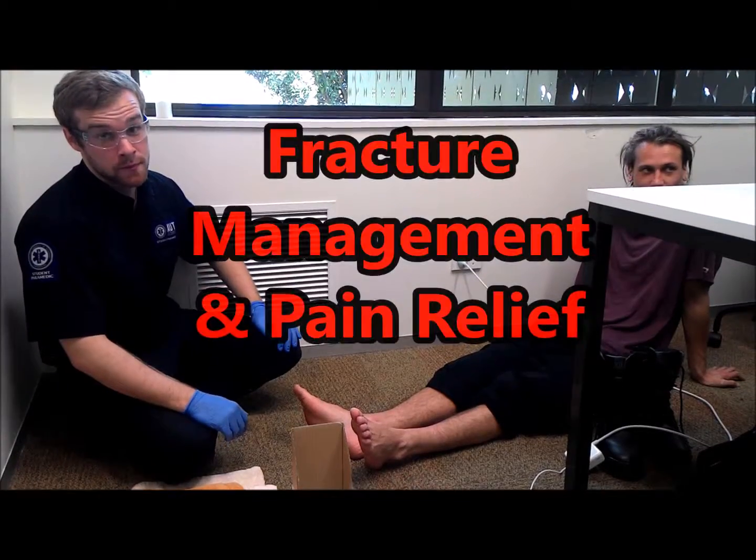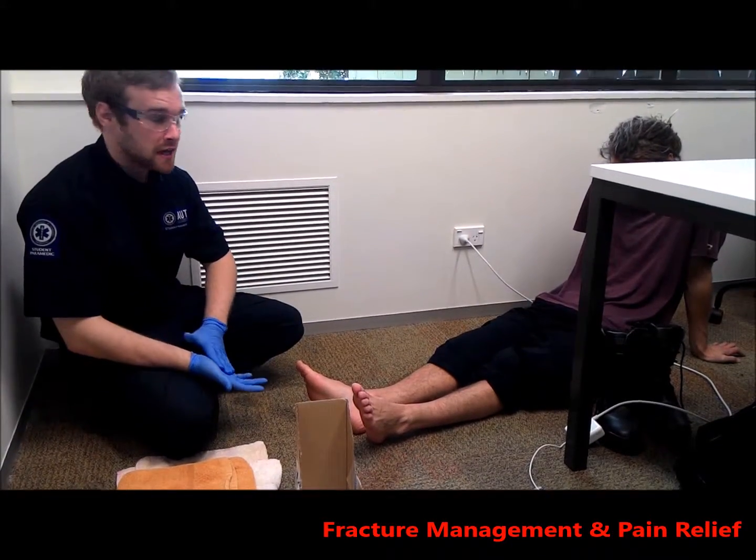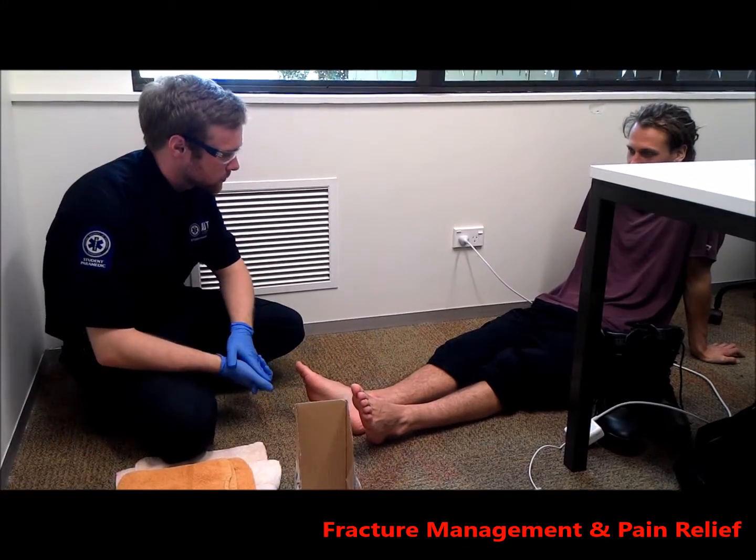Now I'm going to demonstrate fracture management using a box splint. First of all, you want to explain the procedure and gain consent from the patient. So Sam, I'm just going to take a look at your leg here, and I'm just going to probably splint it because it looks like it's broken. Is that alright? Okay, cool.